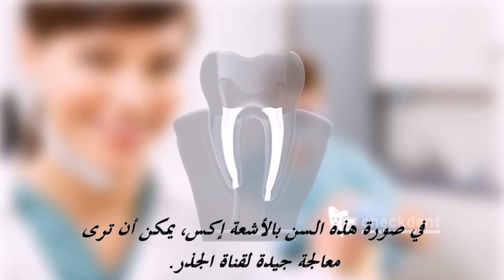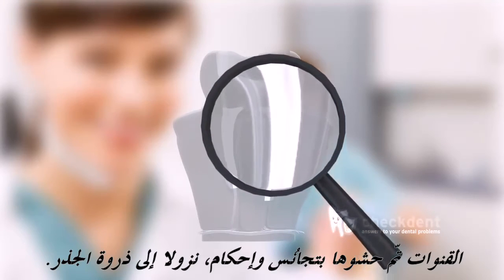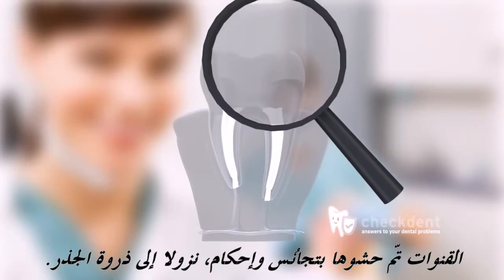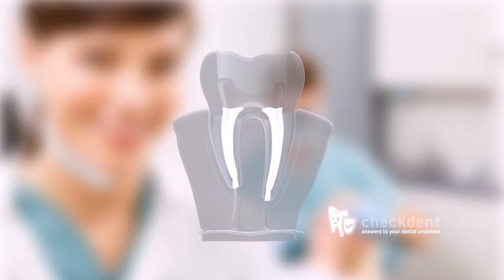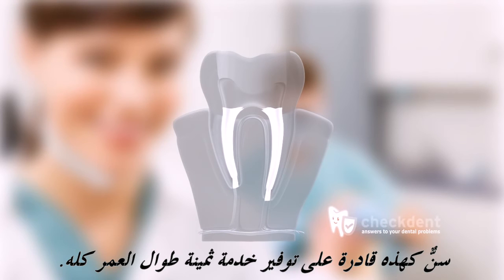On this X-ray of a tooth, you can see a good root canal treatment. The canals have been filled homogeneously and tightly down to the root apex. These filled canals are represented on the X-ray as a light strip within the interior of the tooth. Such a tooth is able to provide valuable service for an entire lifetime.